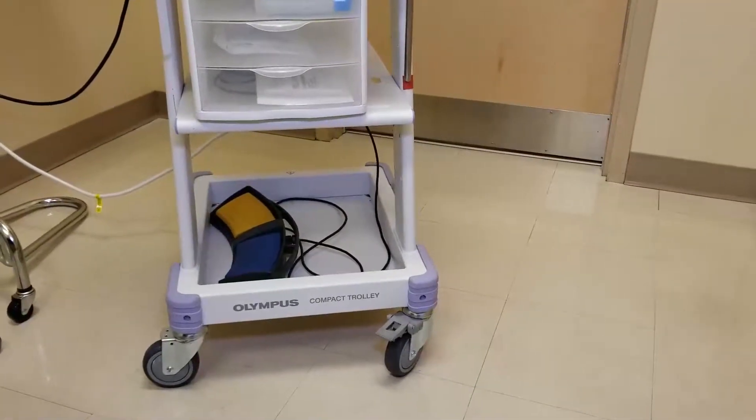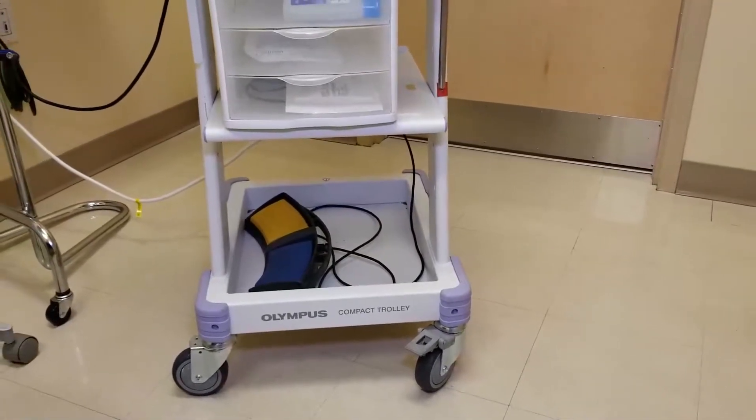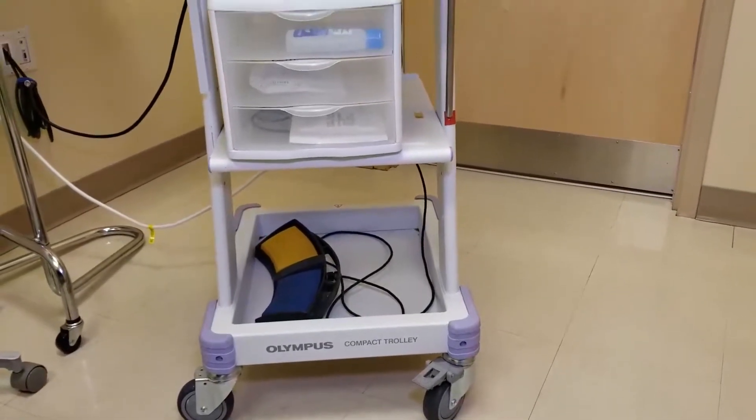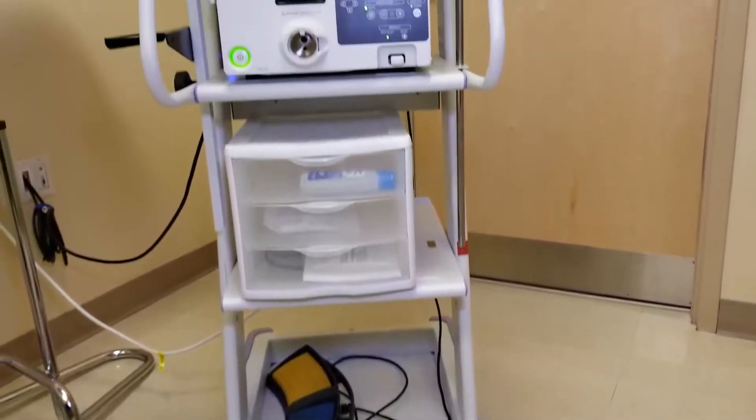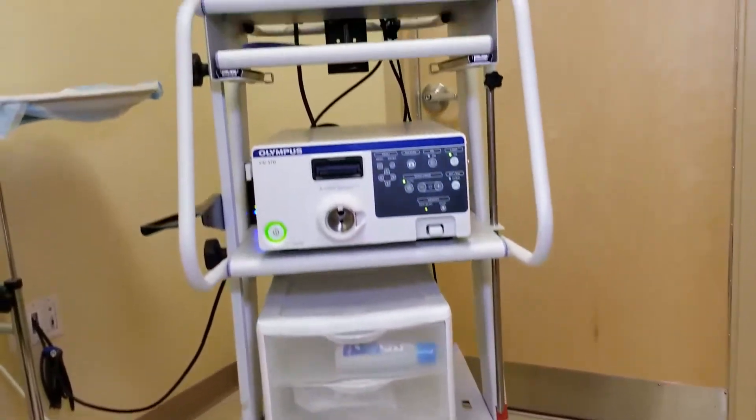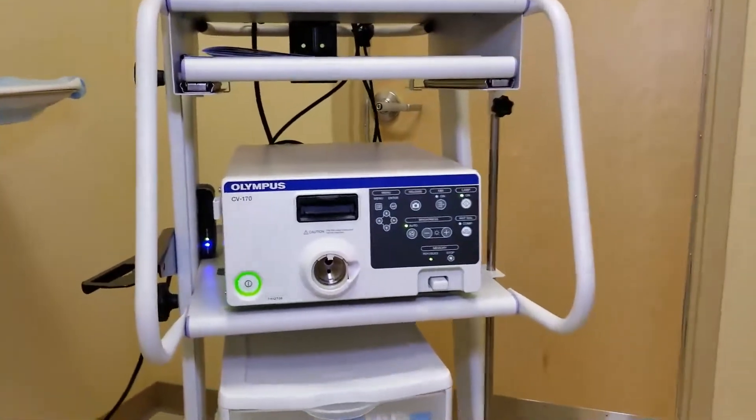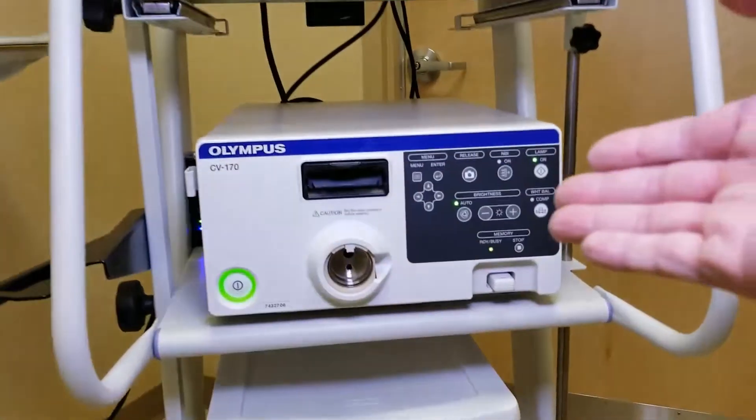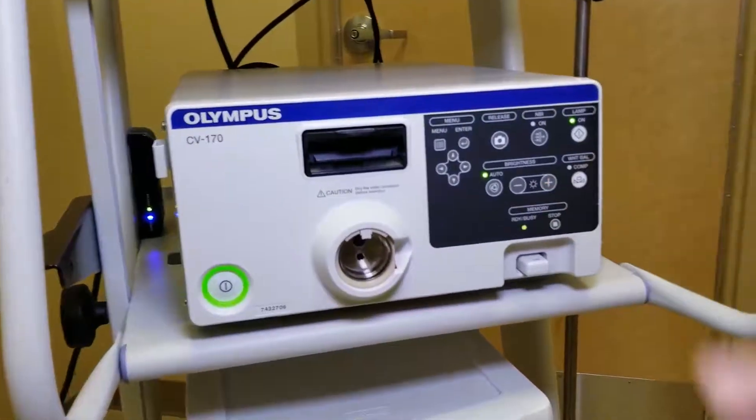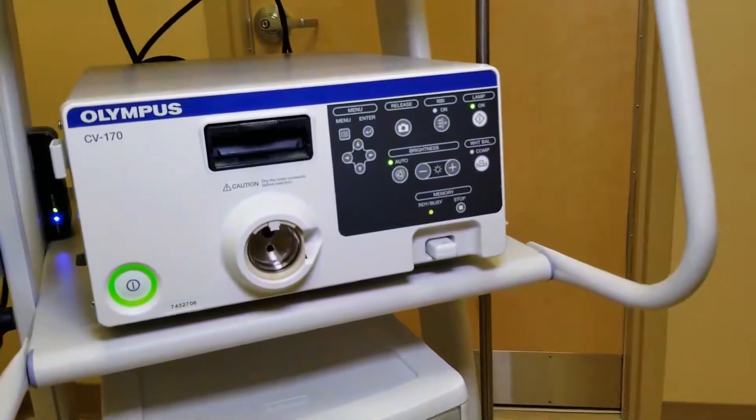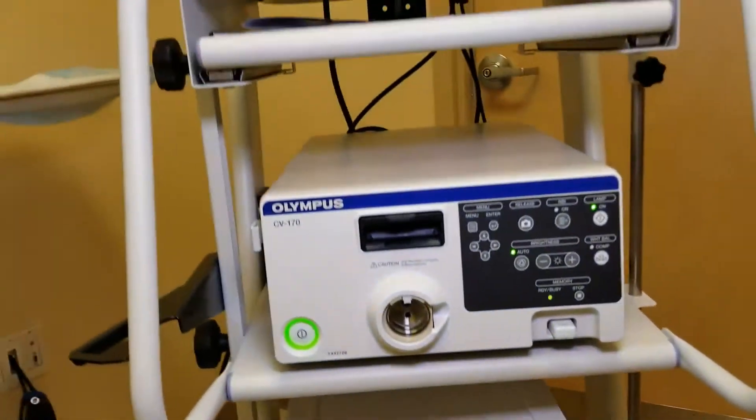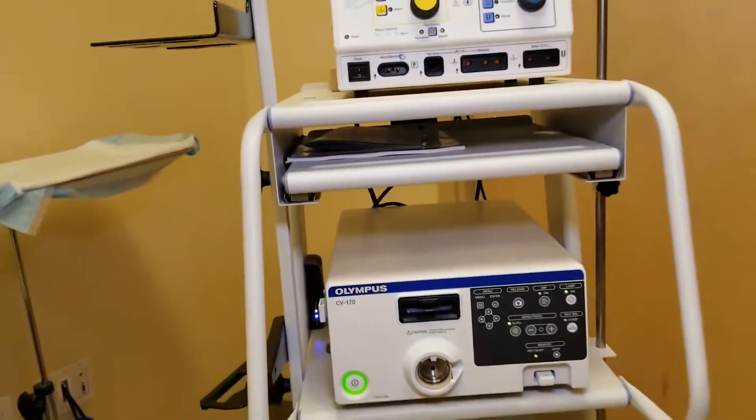Many of us have in our urology offices an Olympus compact trolley with a video processor such as the CV-170 attached to monitors.